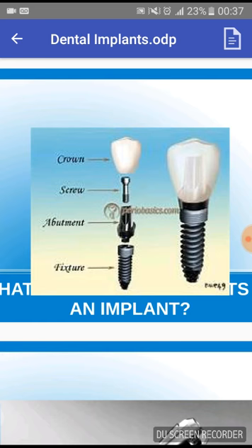The implant must also have a good osteoinductive surface, which speeds up osseointegration. And remember, osseointegration is a very good thing for a dental implant because it allows the formation of strong bone around the implant, facilitating the implant being successful.